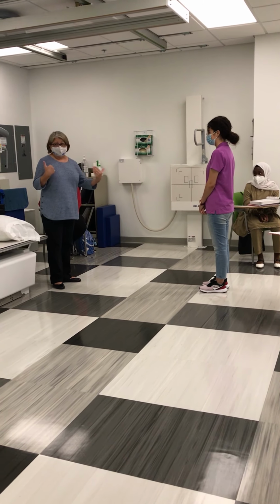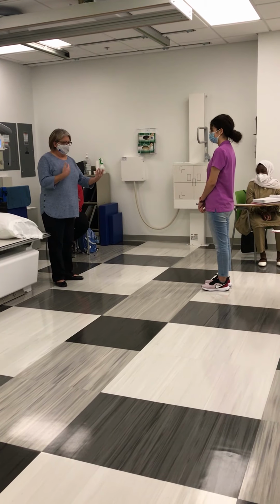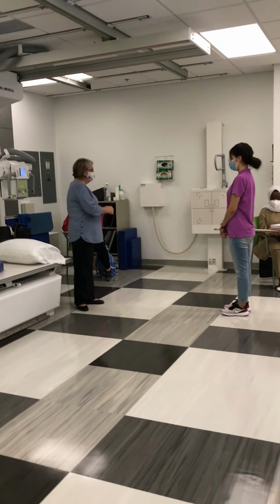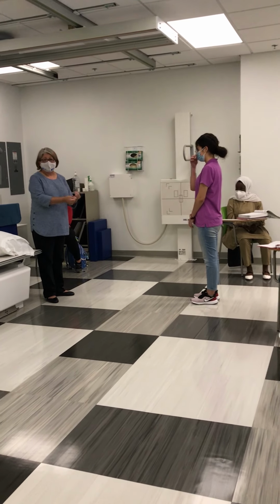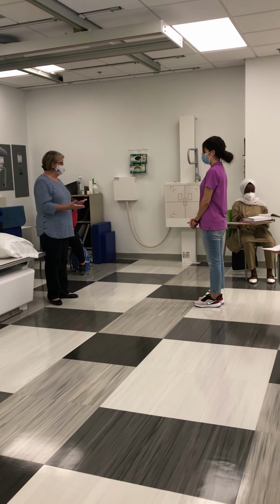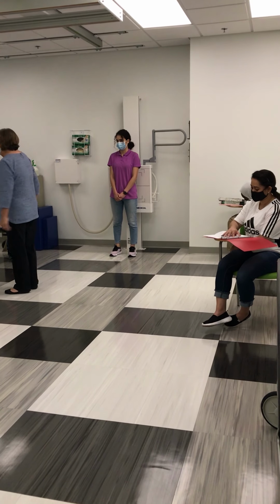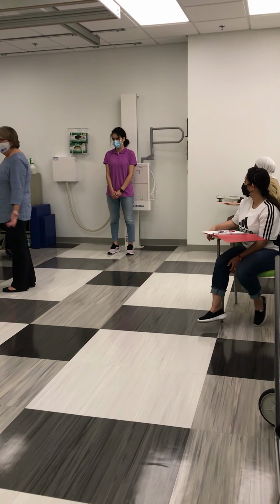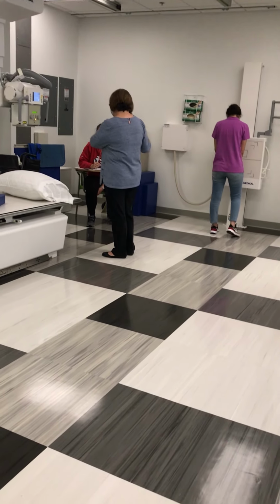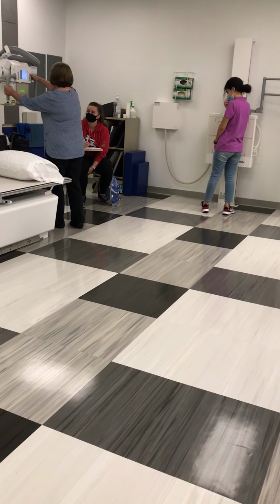So again, this is what you'll go through with your patient for your simulation. You introduce yourself, you ask for the patient's full name, date of birth, and if you have a female patient, you ask if there's any chance they could be pregnant. I'm going to start out demonstrating the PA and lateral chest. Those are two projections, one exam. I'm going to bring my tube over.